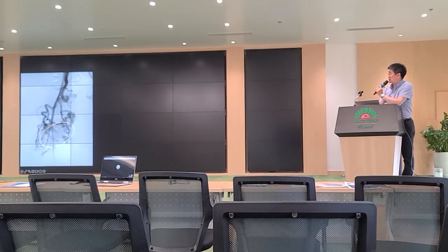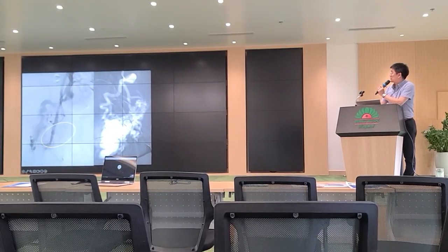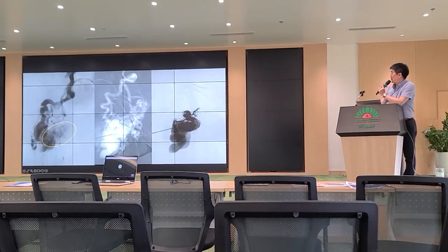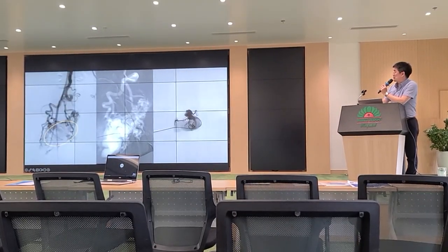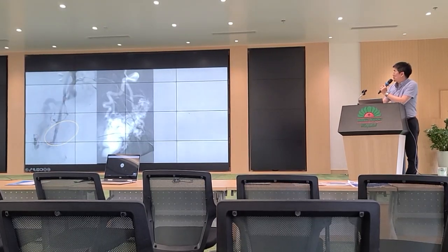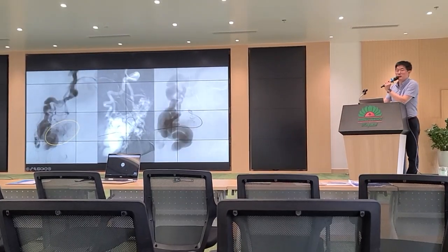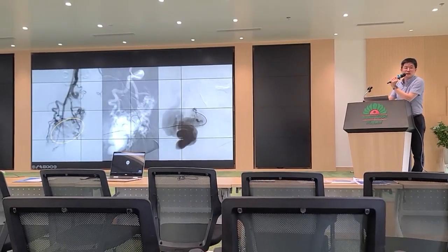We targeted it here with direct puncture. This is the hair wire, and we put the 5 French catheter at the... See the feeding. Yeah, here. This angiography shows feeding arteries. You can see the feeding arteries joining into the nidus.